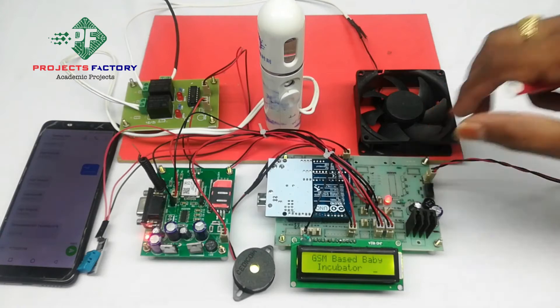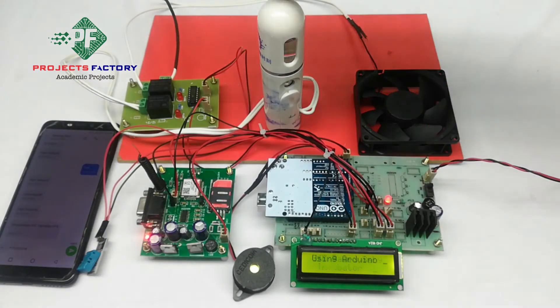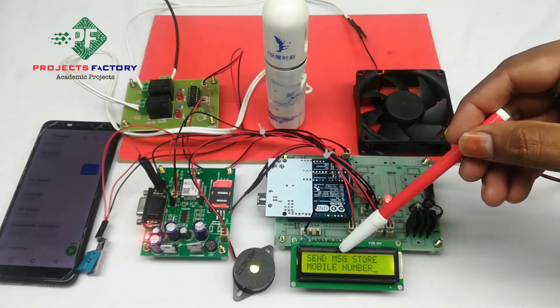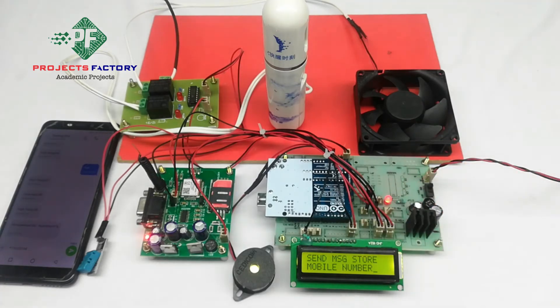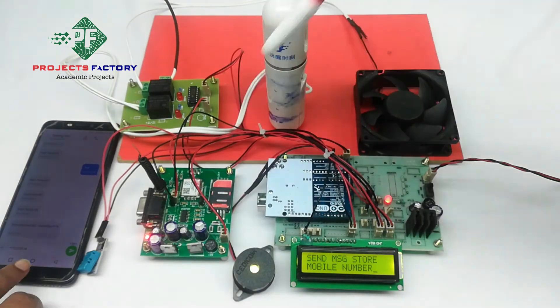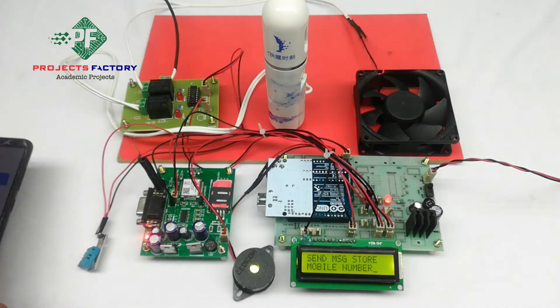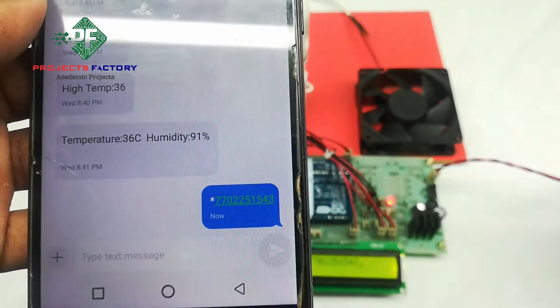Now powering on the system. On the LCD, it is asking to send a message to store the mobile number. We have to send a star followed by the mobile number in an SMS to this GSM modem. The mobile number is then registered.